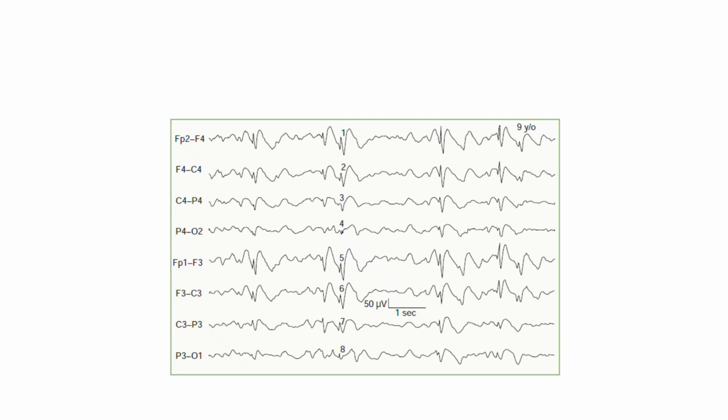The ictal presentation. The caption notes that this specific discharge lasted 12 seconds, during which the 9-year-old boy was unresponsive and demonstrated rhythmic eye blinking. A burst lasting less than 2 to 3 seconds is often subclinical. The patient may not notice it. Once a 3 Hz burst crosses the 3-second threshold, cortical processing is sufficiently disrupted to cause a complete absence of awareness. The rhythmic eye blinking or minor facial automatisms seen here are common physical manifestations that sync rhythmically with the 3 Hz electrical pacing of the spike wave discharge itself.